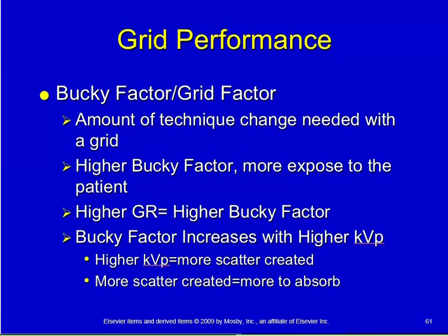So grid performance, as far as technical factors go, your Bucky factor, your grid factor, is what you use to determine how much of a technique change you're going to need when you introduce a grid, or if you change grid ratios from one to another. So the higher the Bucky factor, the more exposure to the patient. The higher the grid ratio, the higher the Bucky factor. Bucky factor increases with higher kVp. Again, I'd refer you to Table 11-2.